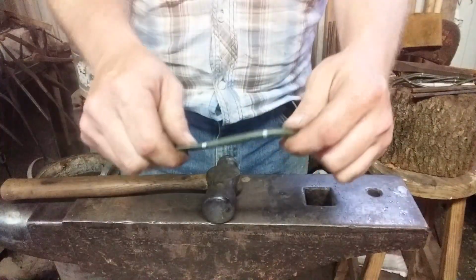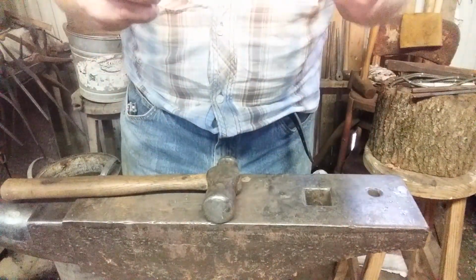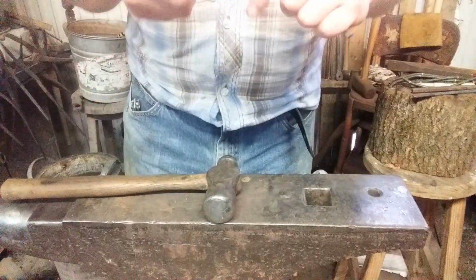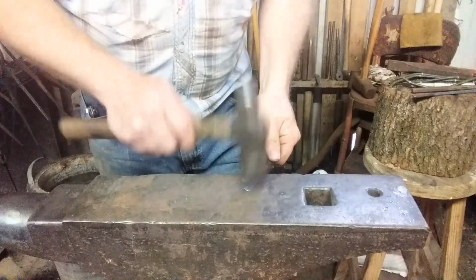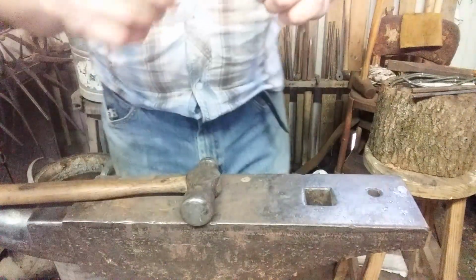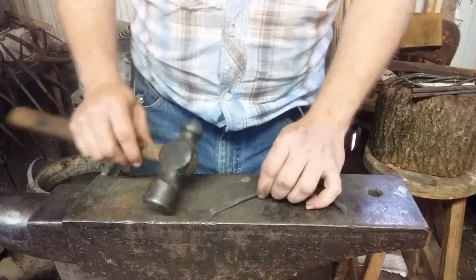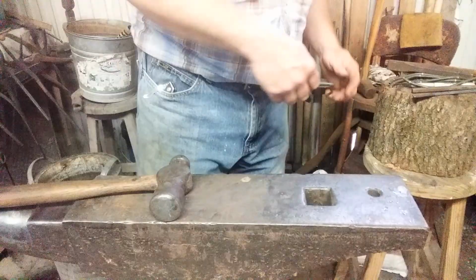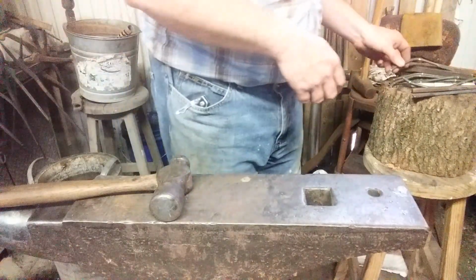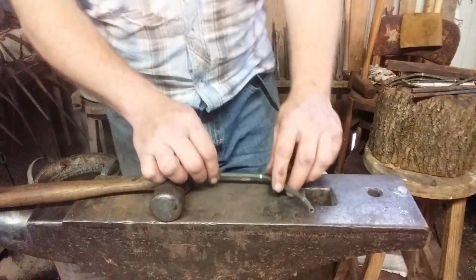And this stuff, brake line, is very rigid. There's even such an animal as stainless steel brake line, which would probably need to be heated. I am not sure. I am not the foremost authority on working with stainless steel, but it would be better for this, I think, because of the anti-corrosion capabilities that it has.